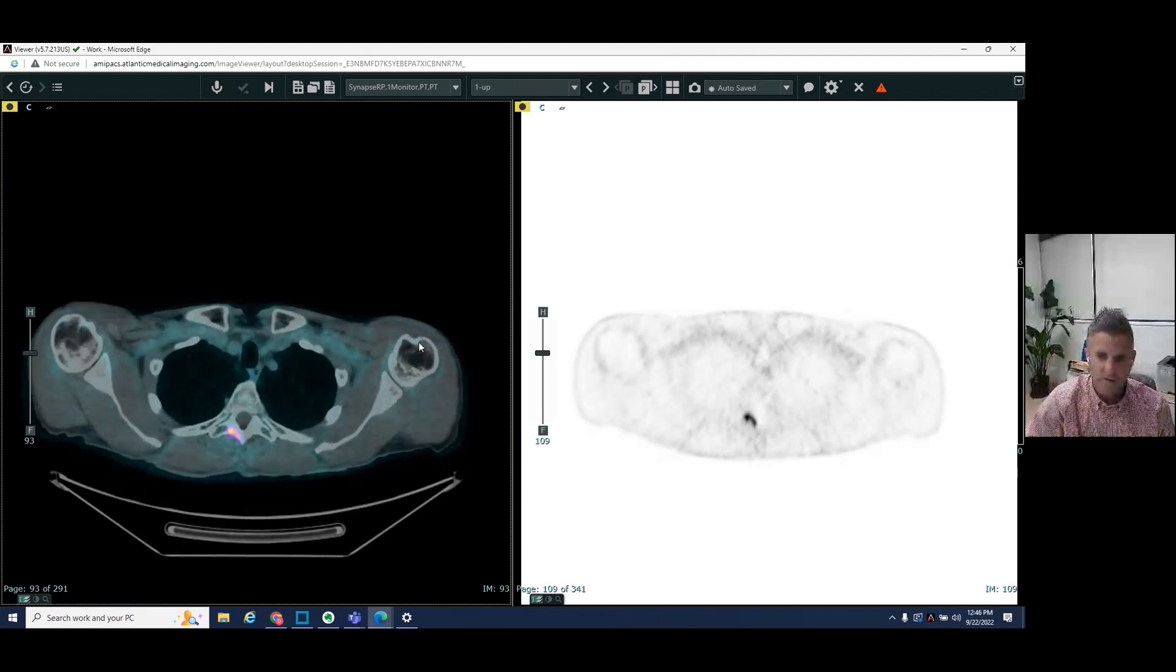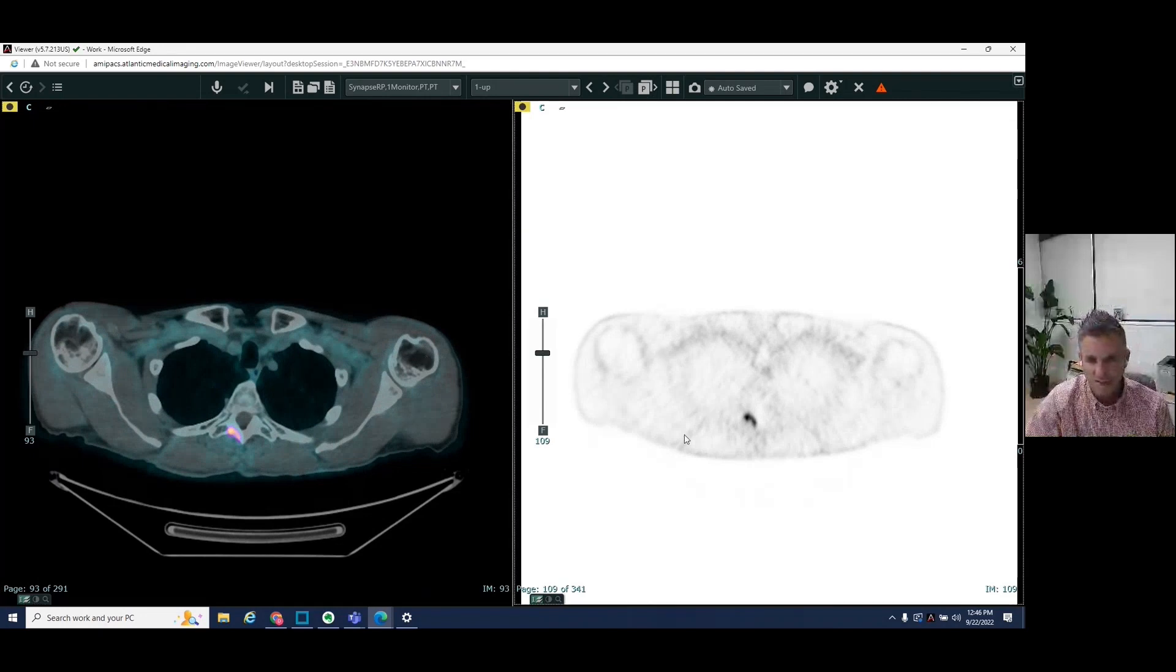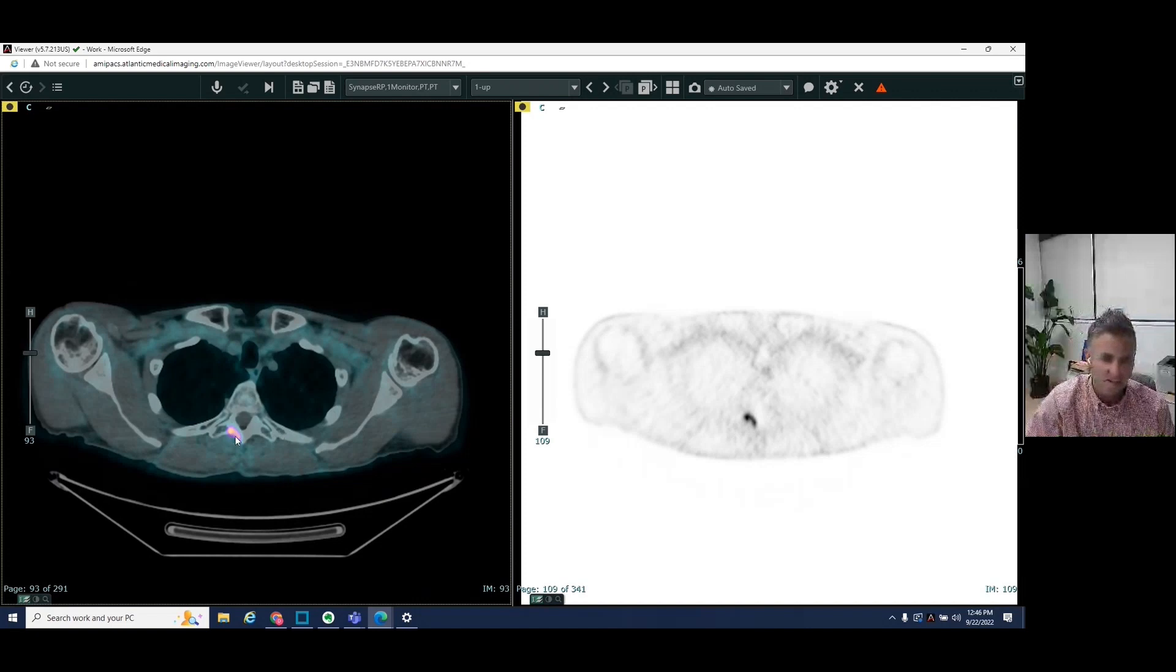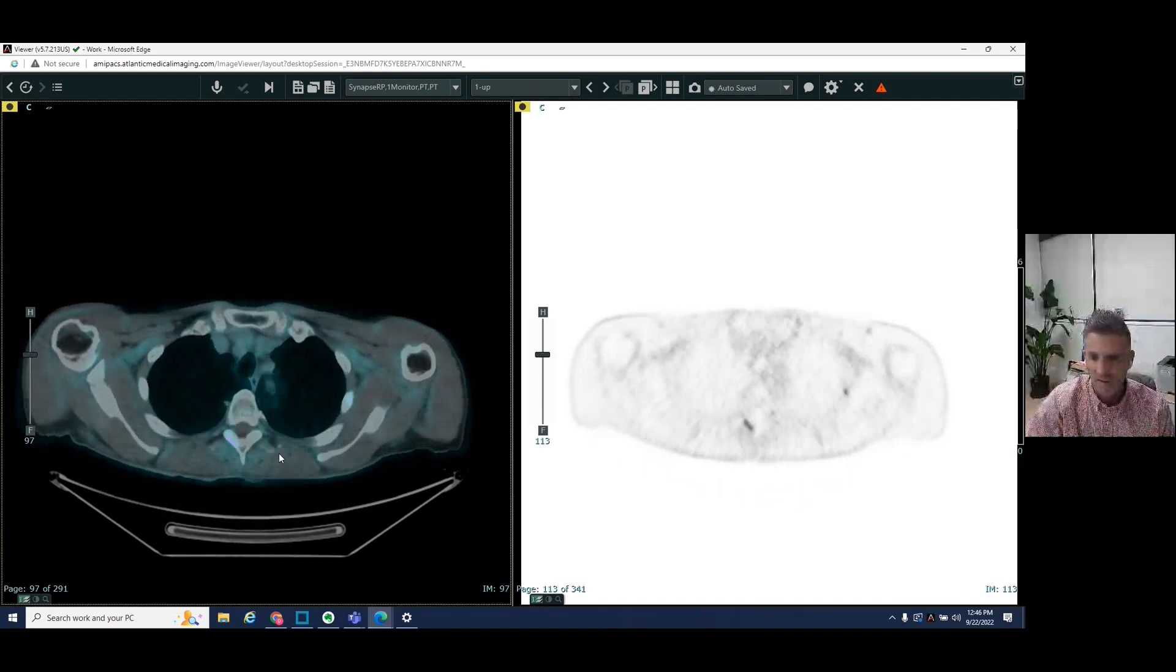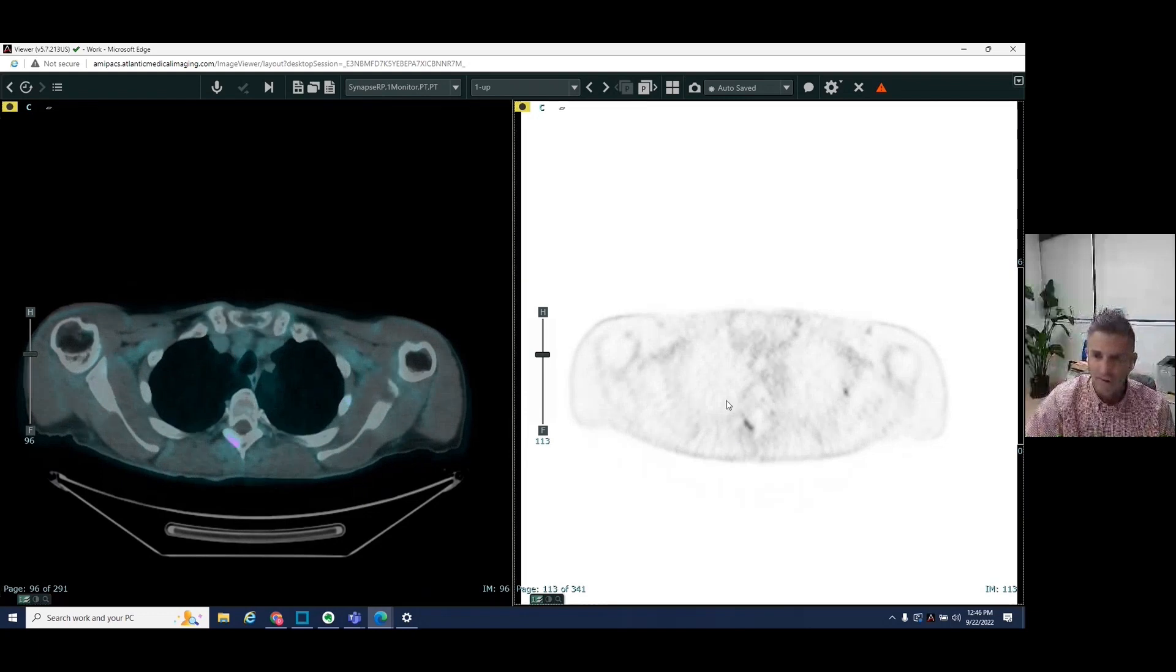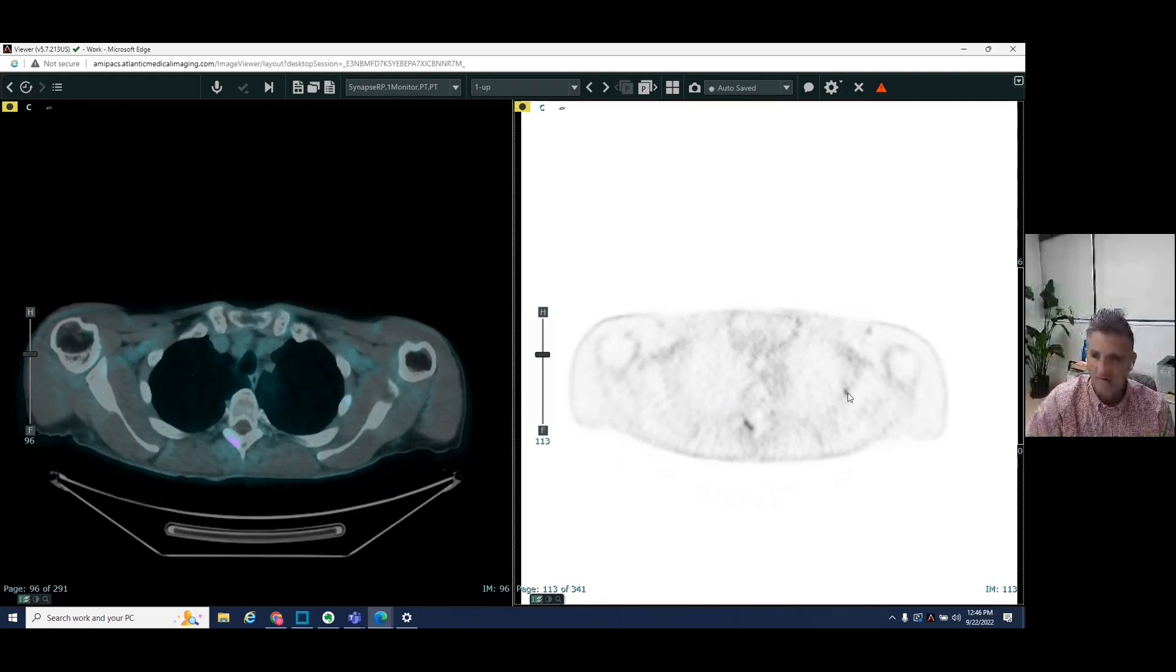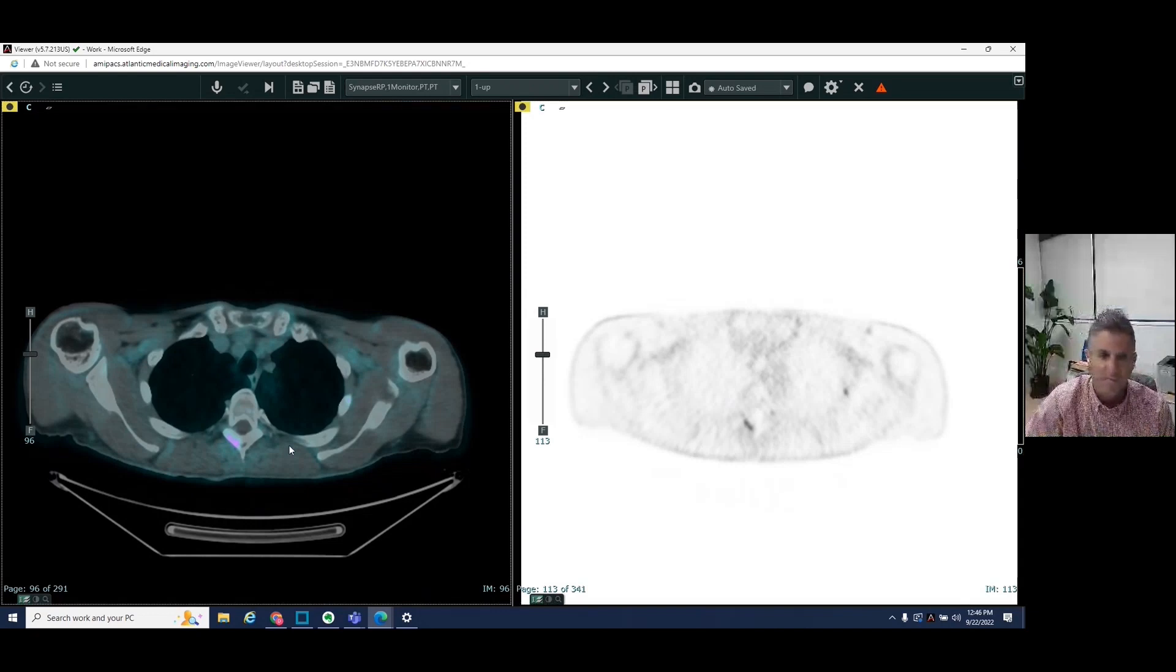So we see in the thoracic spine here, posteriorly on the right, this is hot. You can see it again here, this sort of pink and yellow area. We see another area, really tiny hot spot here in the left third rib.